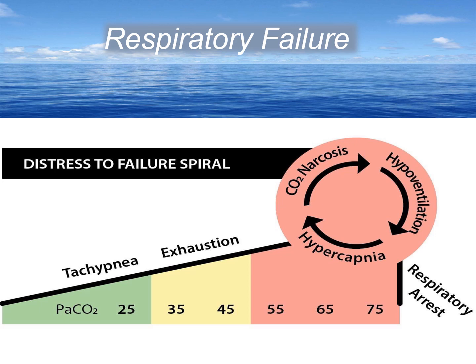As the patient develops further obstruction, we see that increase in end-tidal CO2. Eventually, the patient will become so fatigued that breathing rates slow down, and they develop hypercapnia, and we see an extremely high end-tidal CO2. The rebreathing phenomenon occurs as the patient isn't able to expel their CO2 fully during exhalation. As an example, increasing end-tidal CO2 would reflect worsening ventilation of an acutely tachypneic patient with obstructive lung disease who is developing respiratory muscle fatigue or more severe lower airway obstruction.